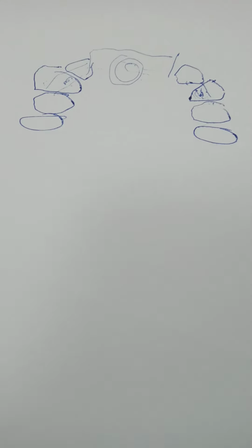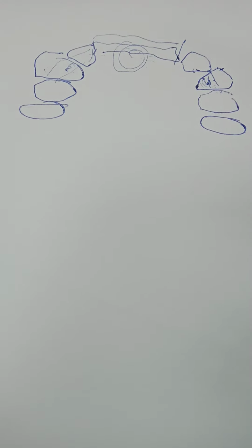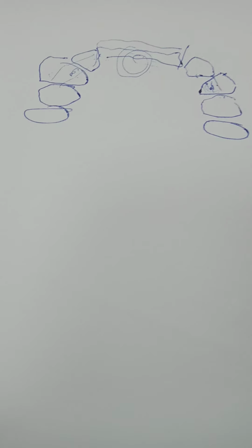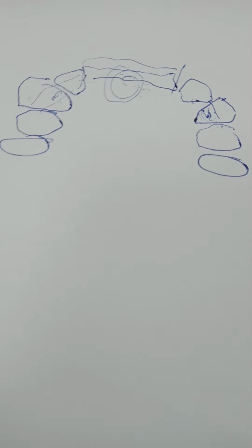But once more, we have another problem in the lower. This saddle or this ridge is sometimes flabby. So I lose the ability to benefit from it, and I go back to the rest. Okay, so I saw it on the cast, but subconsciously I haven't talked about it. The ridge there was very thin, and I felt it was flabby.